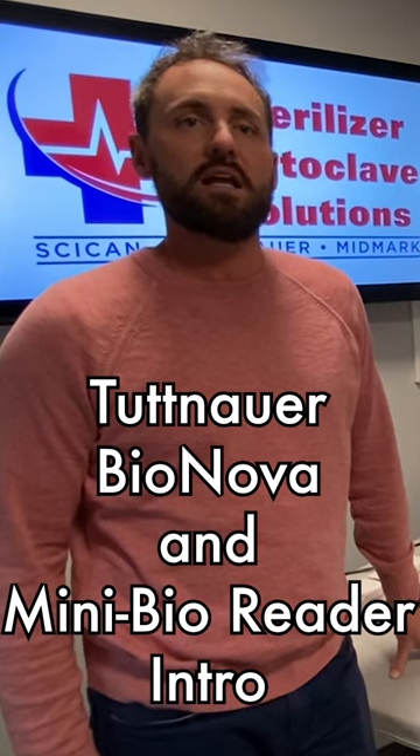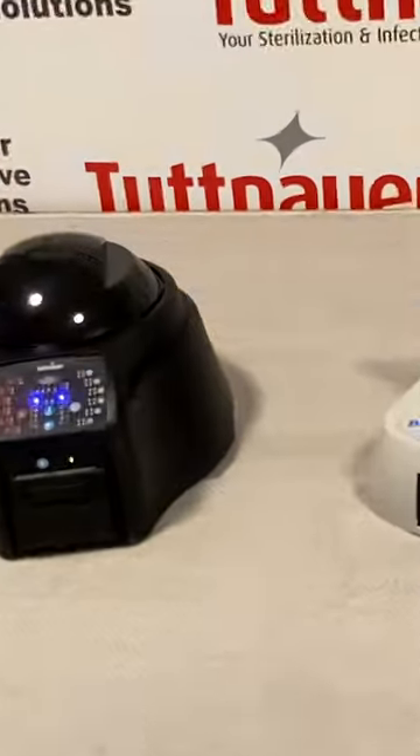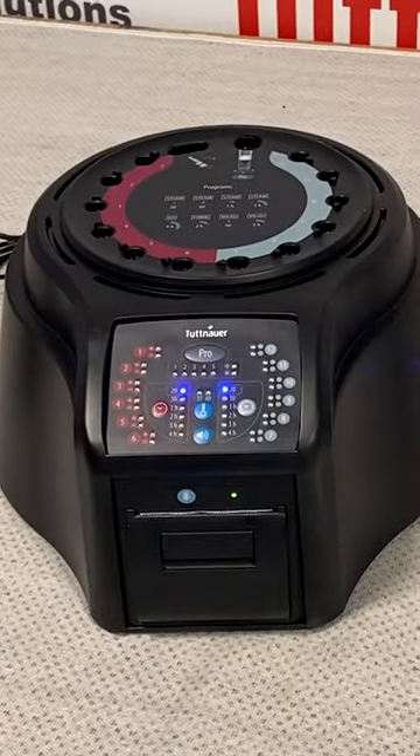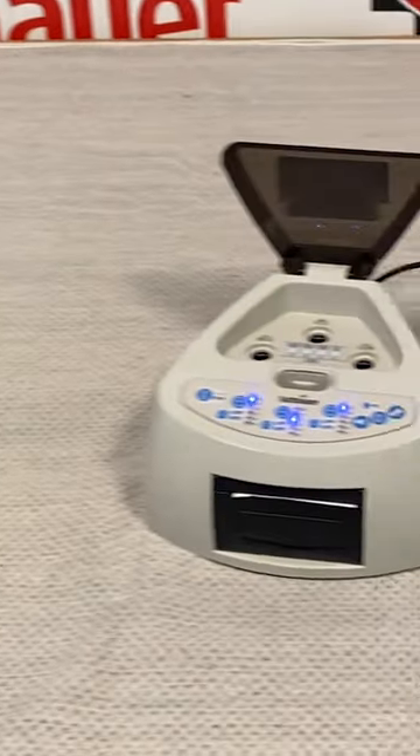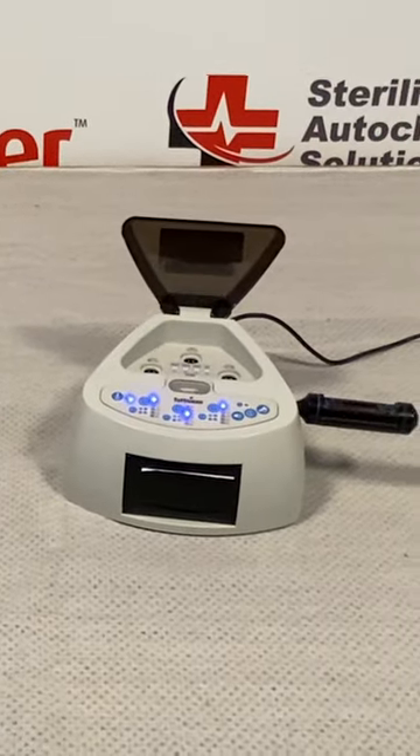In this video, we're going to talk a little bit about the biological readers available through Tootin Hour. There are two readers available: the first one being a 12-slot Bionova reader, and the second one being a 3-slot mini Bionova reader. Both are available in 37 or 60-degree reads.